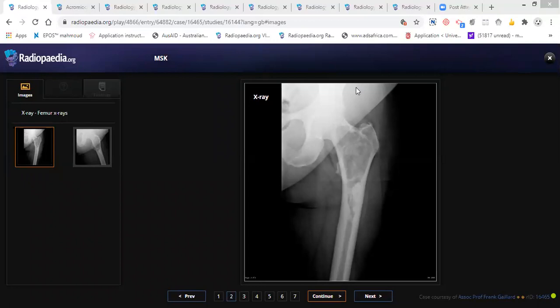The hamstring avulsion is at the ischial tuberosity, not at the pubic tubercle. But you should be aware of them. They like every avulsion in the exam, very, very much, in any exam you will get.